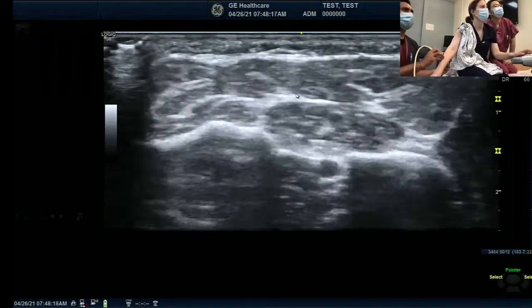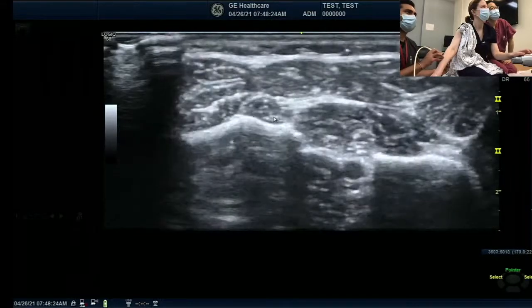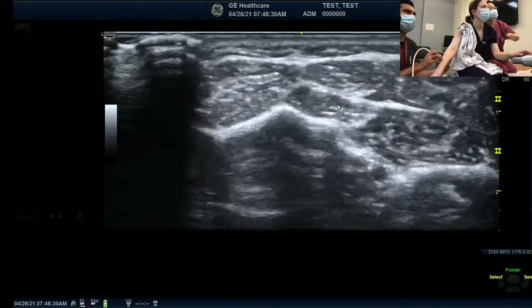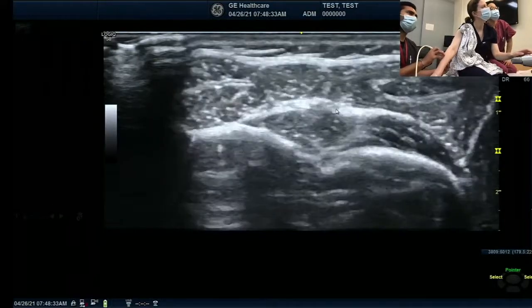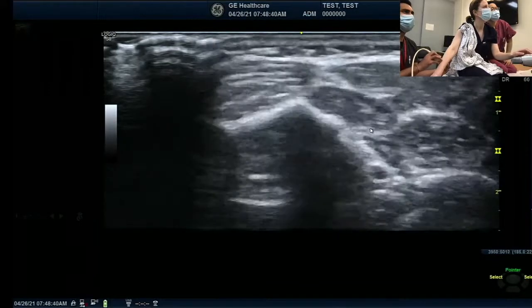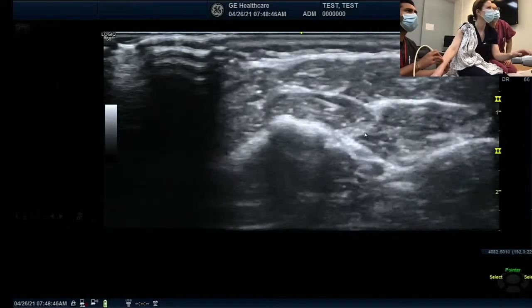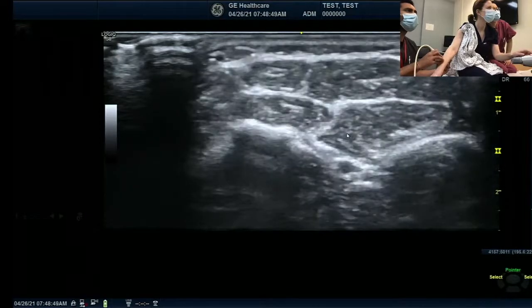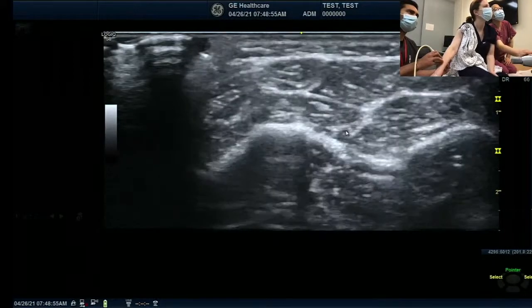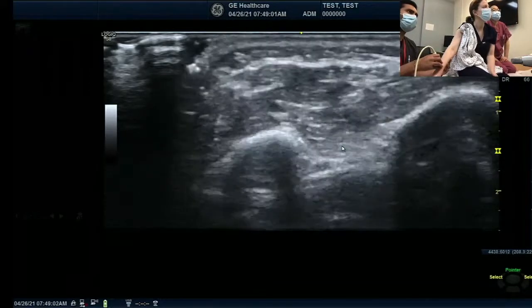Neither of the branches is easy on me. Then move back and forth to look for the posterior interosseous nerve going into the posterior interosseous membrane. You have to move fast but scan slowly; when you move, scan fast, and you can see the posterior nerve better. That's along the fascial line. There is something white that's moving. I think this is the one. It's coming into the posterior interosseous membrane and continues downward to the wrist joint.